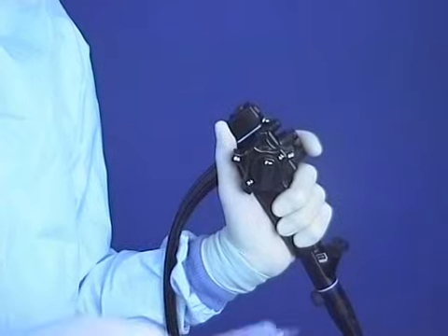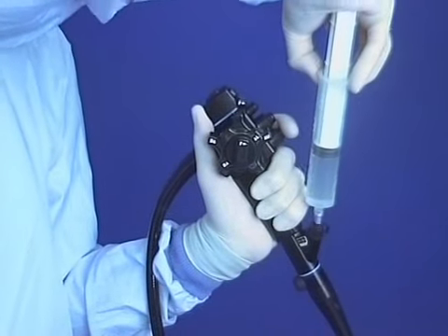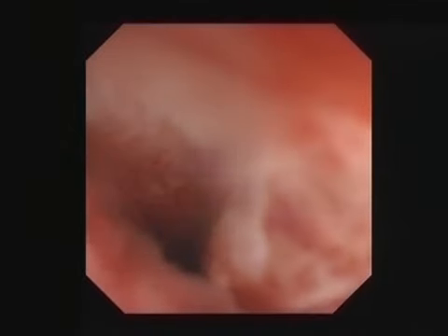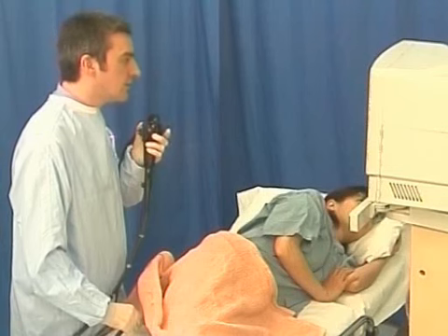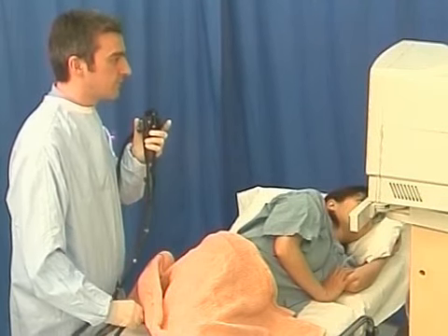Even so, the view can be very poor. Underwater endoscopy occasionally helps in diverticular narrowing or stricture, water holding the folds away from the lens and giving a better view. The endoscopist should concentrate entirely on the screen view, even while talking to the patient.